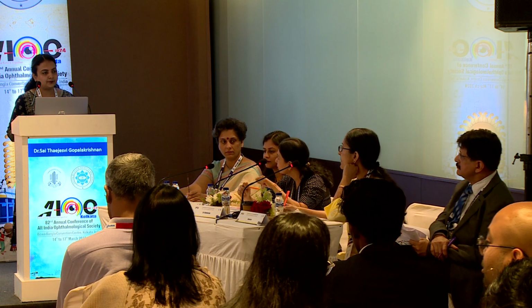That's what we do routinely. We just hold it for a minute. Ma'am, we allow the autologous blood to act as an adhesive. Just hold the edges together, pinch it and keep it for a minute. It will seal.